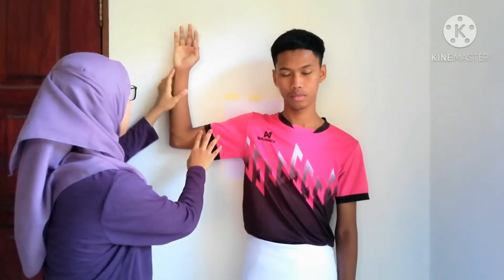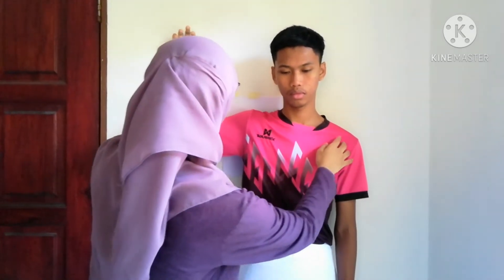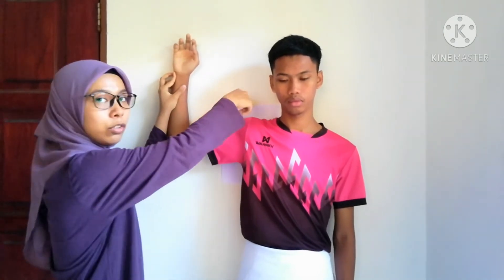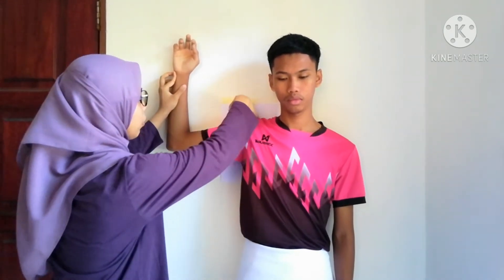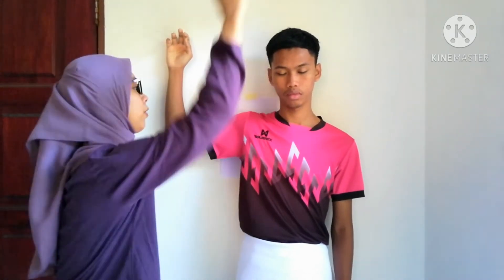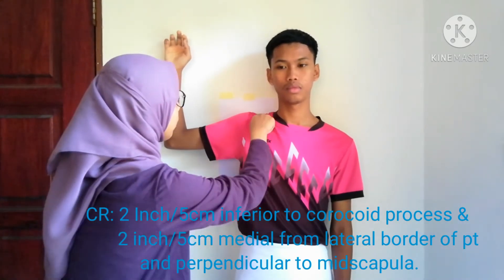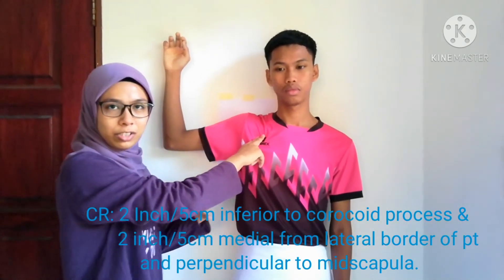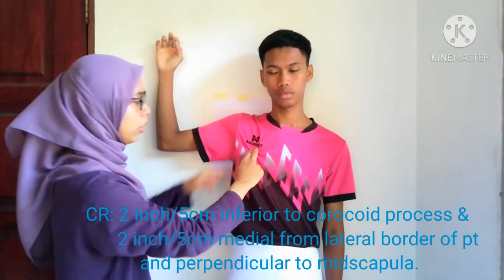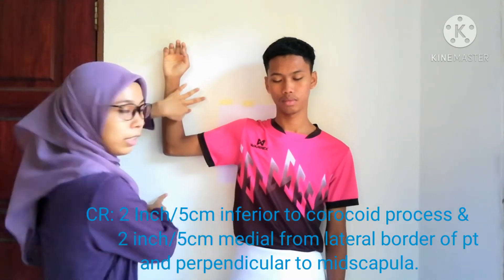Abduct the arm of the patient and flex the elbow 90 degrees. Make sure the top of the IR is 2 inches from the shoulder. For the CR, it is located 2 inches inferior from the coracoid process. Make sure it's centered to the cassette.